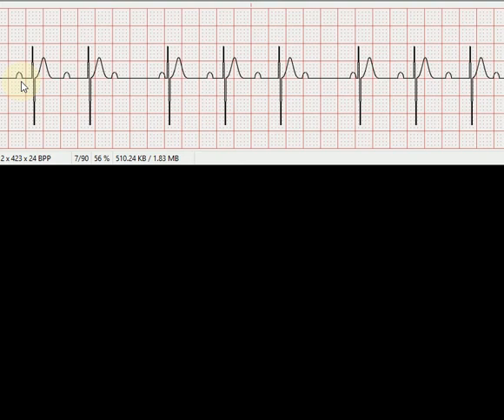Okay, so the QRSs here are narrow, clearly. They look all consistent. The P waves are round, upright, and symmetric. This is all nice and computer, so it fits all the rules a little bit better. My PR ratio, well, 1 to, whoa, nope, I've got an extra P wave in here. So it's not a 1-to-1 PR ratio. I have more P waves than I have QRSs.